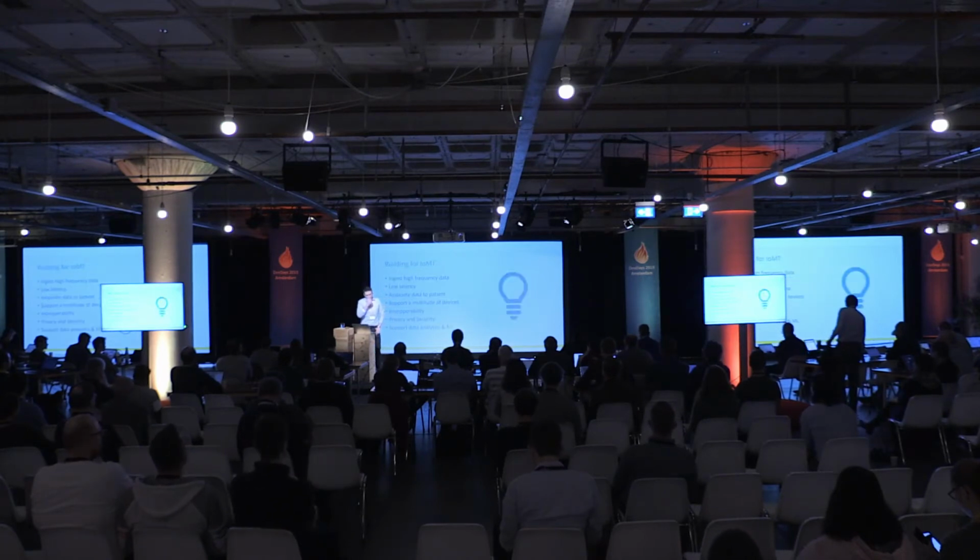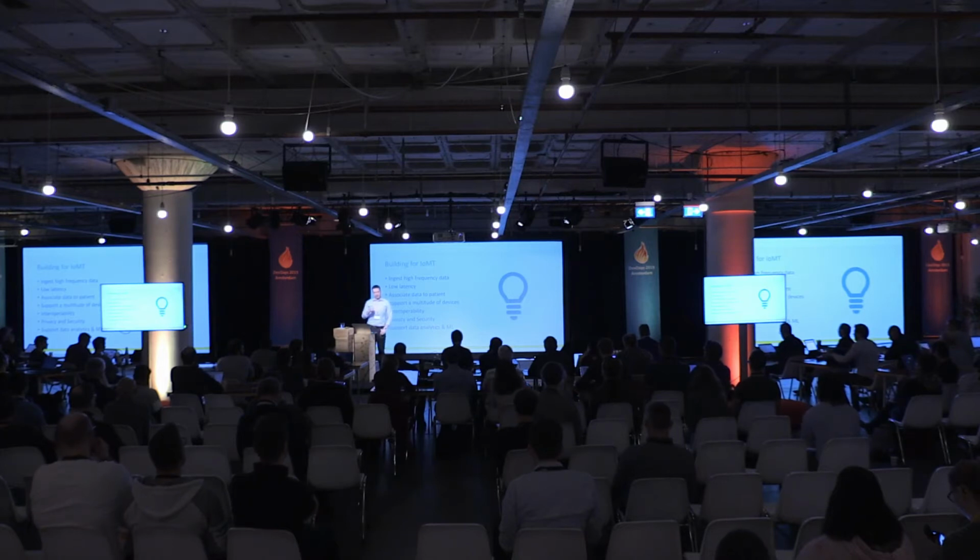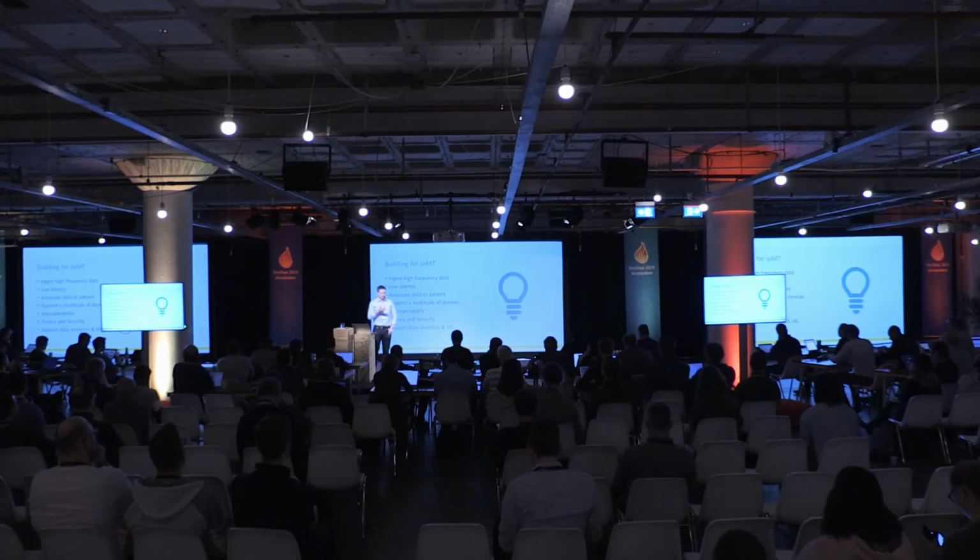So what are some things that we were looking for when we were building for IoMT? One of the key points is we wanted to be able to handle the high frequency, high fidelity data sets. There's a lot of scenarios where you may have a few measurements a day, and those are important, and they have broad applications.